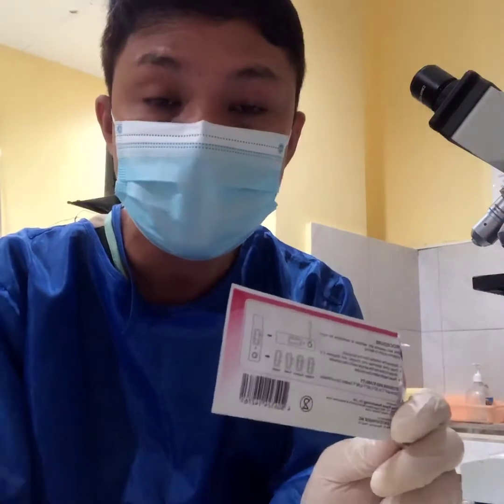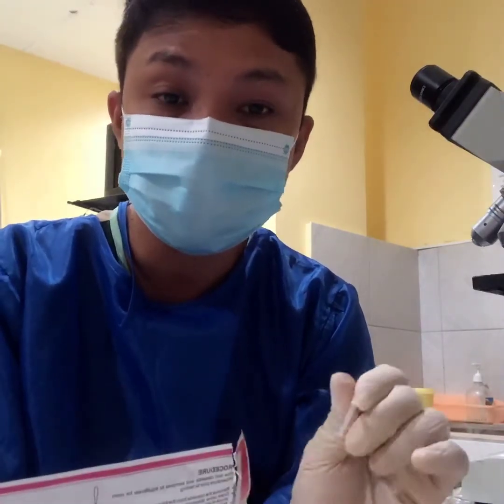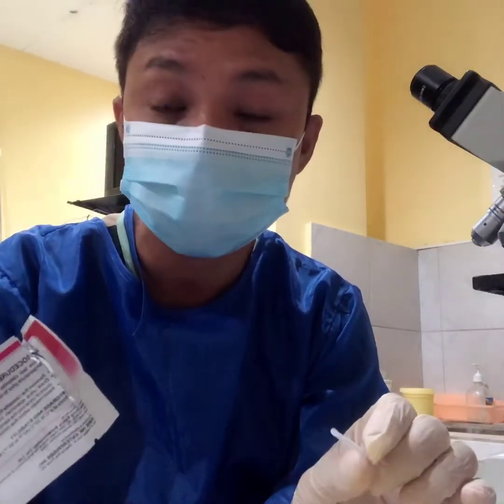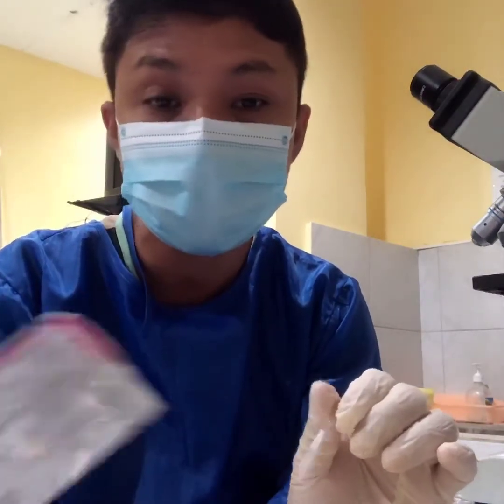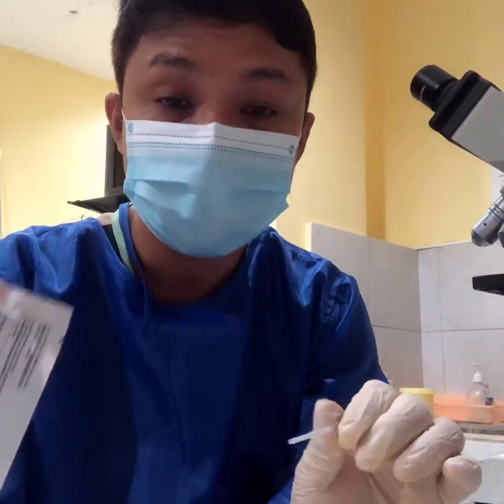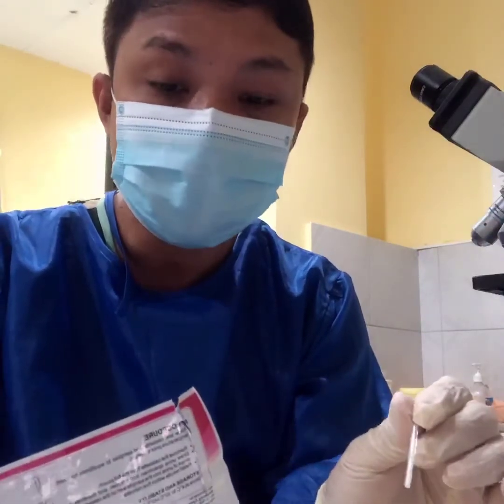So we need to discriminate whether the patient is really pregnant or has an H-mole if the patient gets a positive test result. You can have an ultrasound to check if the patient is really pregnant, or if the patient is positive not because of pregnancy but because of H-mole, which can be detected in the ultrasound since there is no baby. Again, the procedure says we only need 2 to 3 drops of our urine sample.